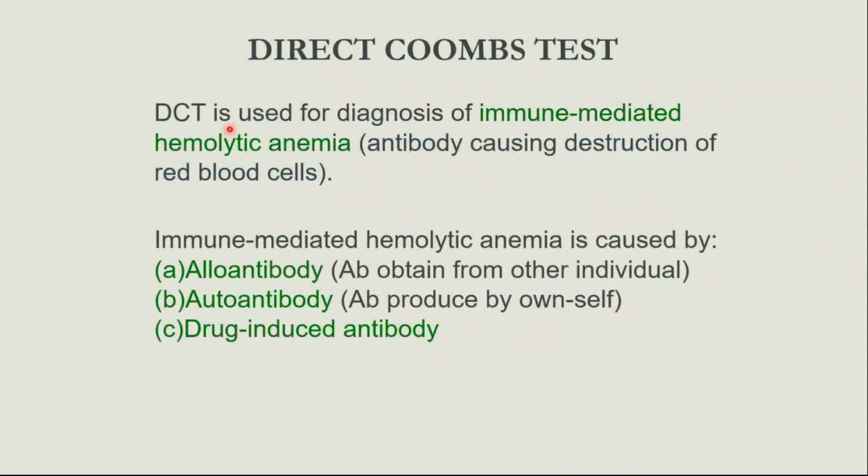Okay, the direct Coombs test is used for the diagnosis of immune-mediated hemolytic anemia, and it is caused by alloantibody. Alloantibody is antibody obtained from another individual. Autoantibody is produced by one's own self. Okay, autoimmune, autoantibody, and drug-induced antibody.